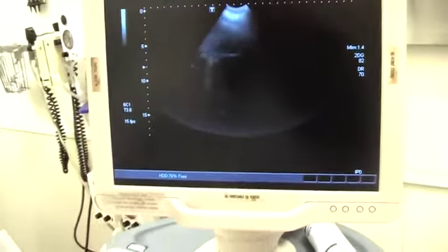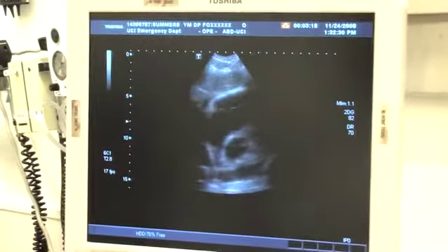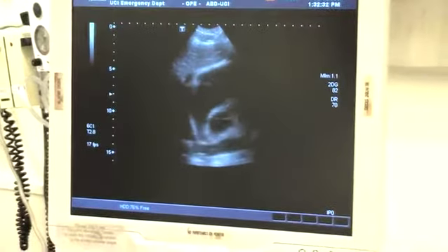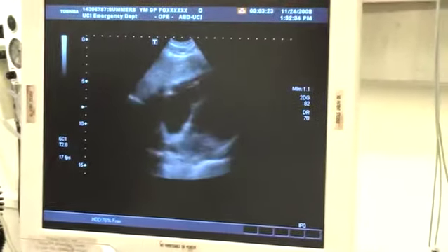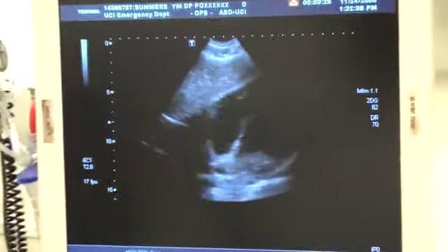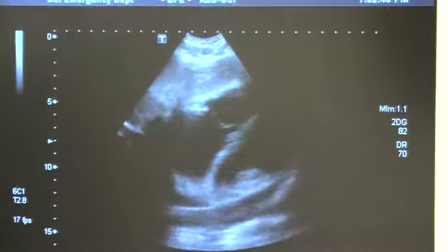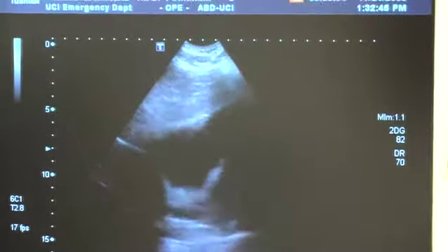All right. So the heart. It's a four-chamber view of the heart. What we're looking for in a trauma situation is global contractility of the heart. Is it beating away at 120 beats per minute with the ventricle walls totally collapsing? And is there fluid around the heart? So it looks like she's got normal contractility, and I do not see any pericardial effusion.